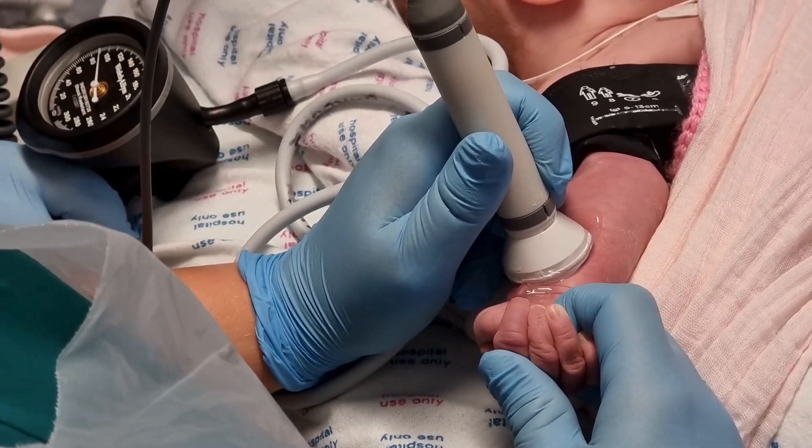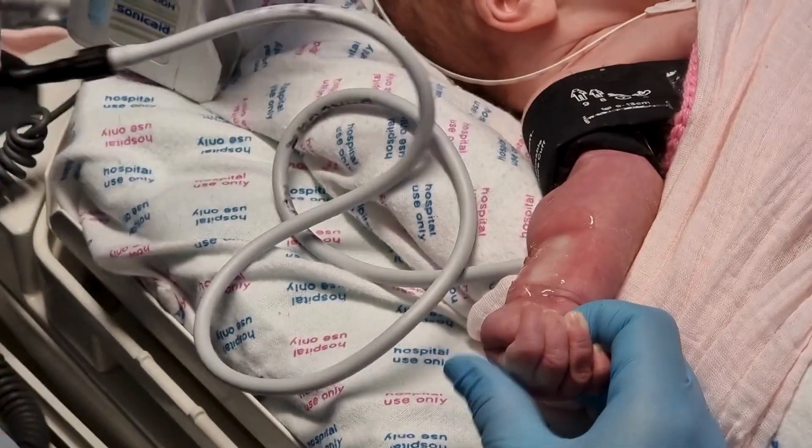You can then reduce the cuff fully and release the baby's arm. That was how you measure Doppler blood pressure in a neonate. I hope you find this useful. Feel free to check out our other Neosim videos online. Bye!